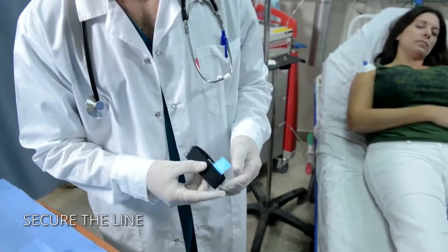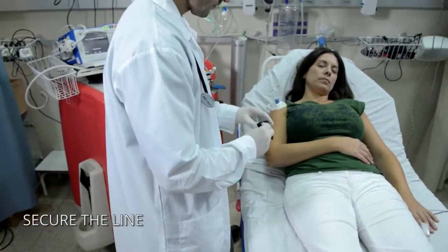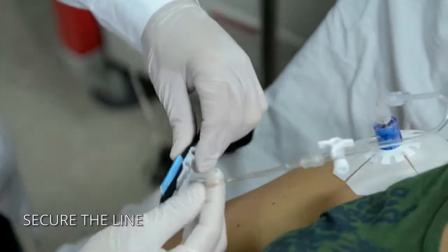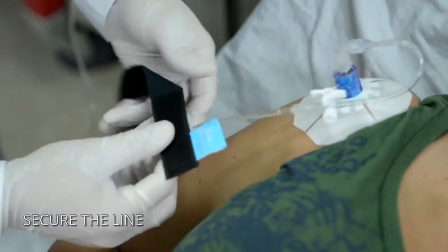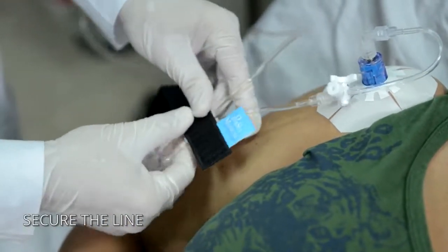Use the secure IV to provide protection against accidental line pulls. Snap the line into the quick click connector channels and wrap the strap around the patient's arm near the access site.